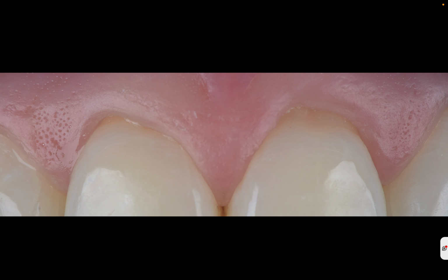Regarding the adhesion, it's not the best in the world in that area. It's true. Why? Because there is no enamel, probably it's just dentin or root, and also we don't have full isolation.